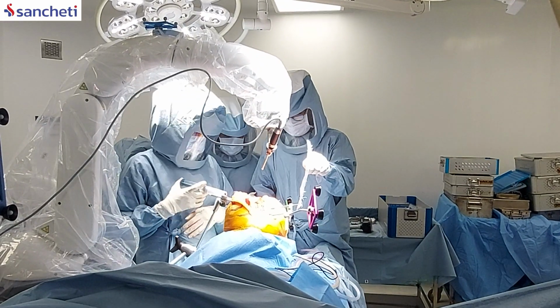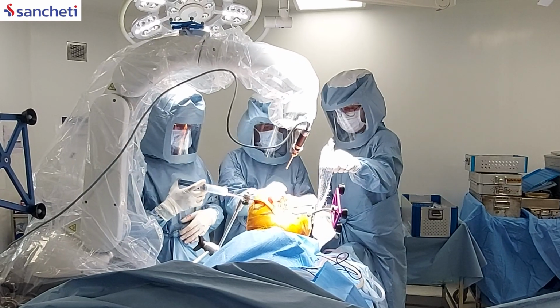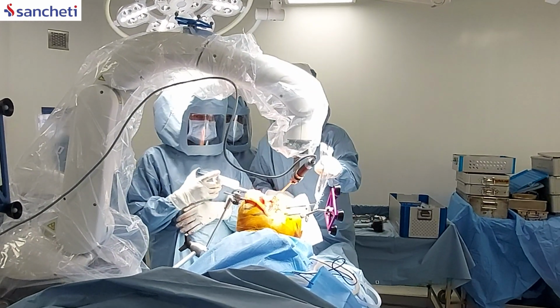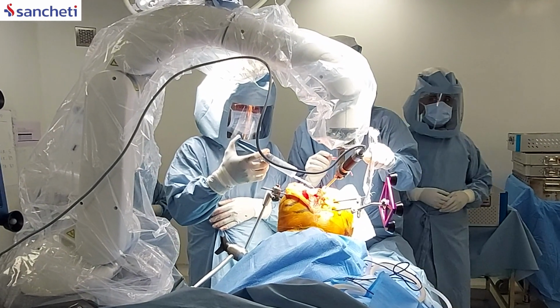So once this part is done, the main part of the surgery day comes, where the patient is prepared according to a standard knee replacement. The only thing added is that we spend some time feeding the knee information to the robot, which is known as intraoperative marking of the bone structures and intraoperative mapping of the knee joint. Once this mapping is done, the surgeon moves aside. Then we give the final go to the robot.